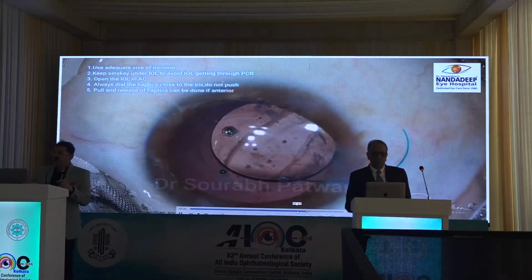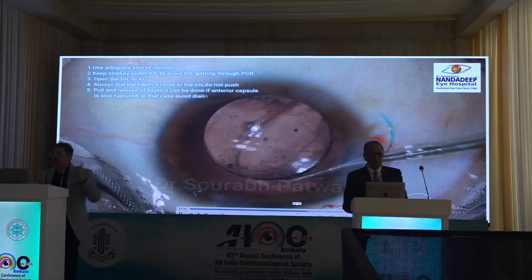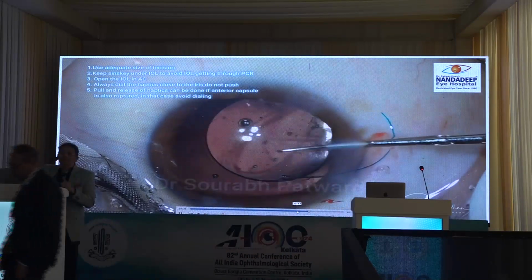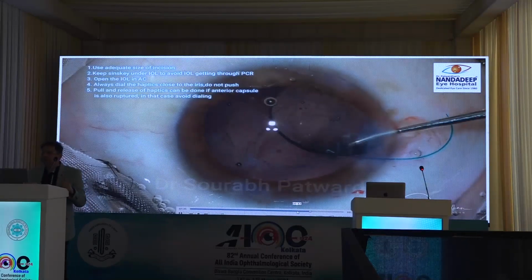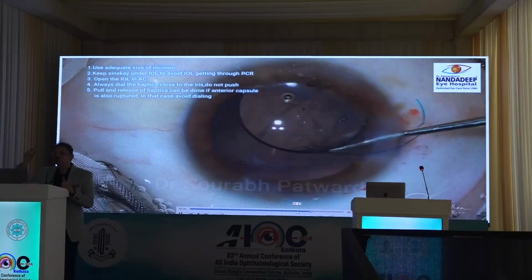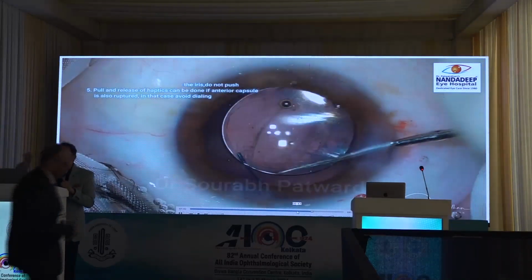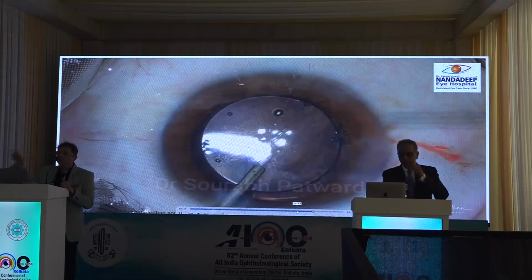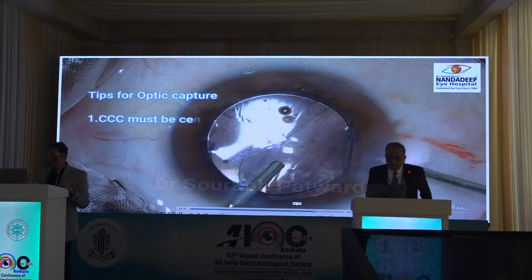Okay, so just to show, now the IOL is in the anterior chamber. I am going to dial these haptics inside and just watch. When I dial, I make sure that haptics are actually touching the iris while they are going into the sulcus, to make sure they are not going anywhere else. This is more important when you have a larger CCC where you might be a little doubtful about the CCC margin. It's always a good idea, if you have a small pupil, to use iris retractors before you inject the IOL rather than struggle with visualization.